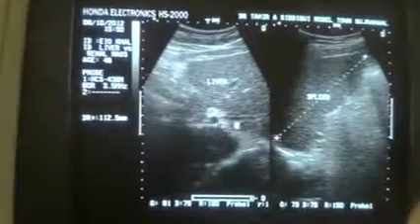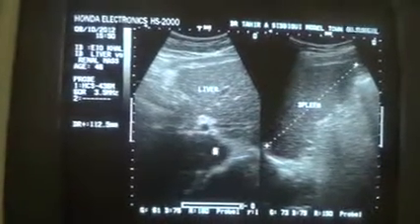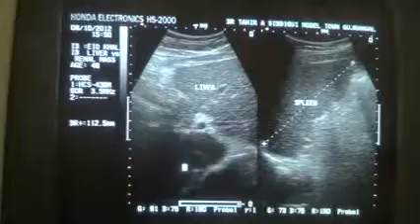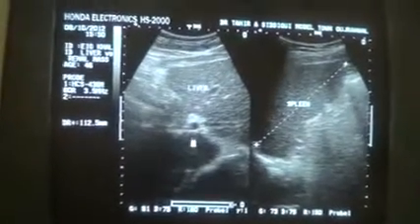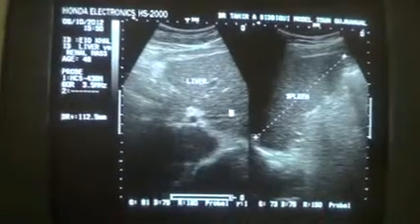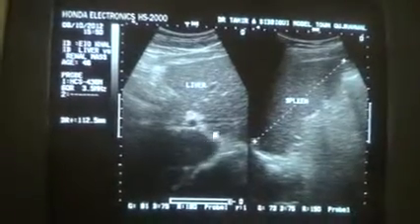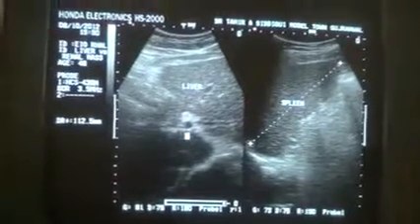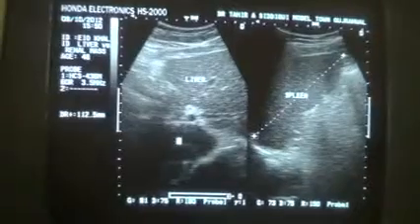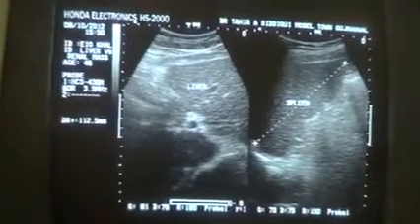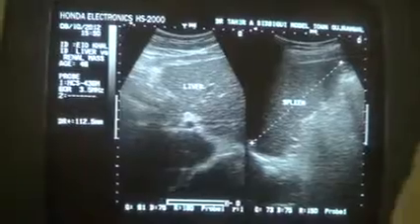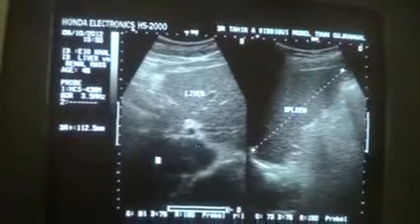This is the transverse section of the left lobe of the liver and this is the ligamentum venosum. This is the caudate lobe of the liver. If you see that the caudate lobe of the liver is hypoechoic — less bright — compared to the adjacent left lobe of the liver. The reason being that the caudate lobe has its own separate blood supply and therefore, in most cases, is not involved in the cirrhotic process, thereby giving a normal echogenic pattern.